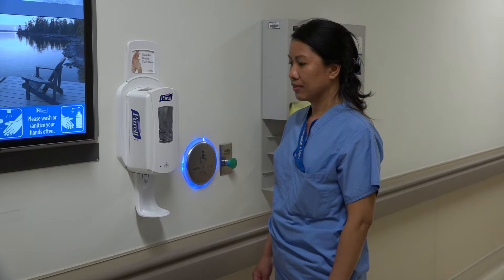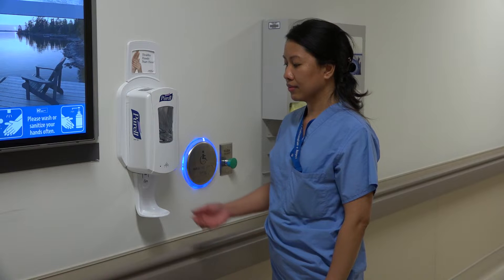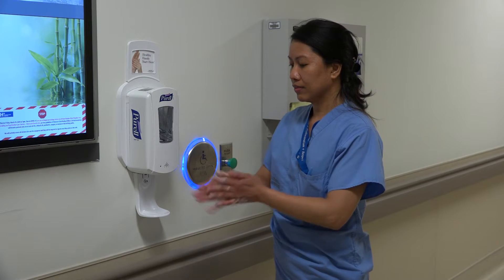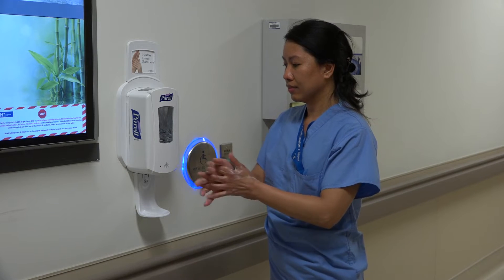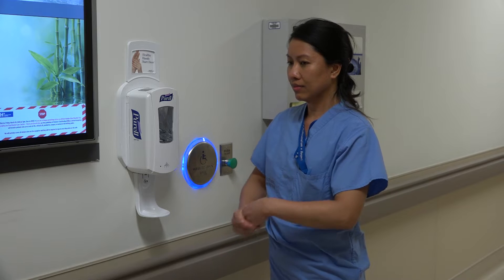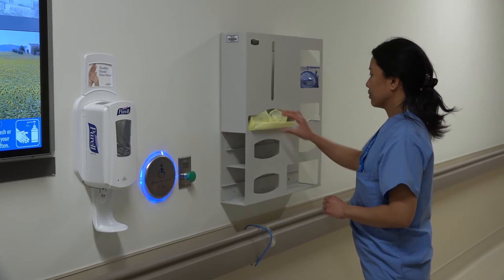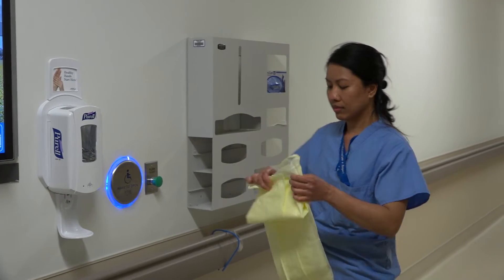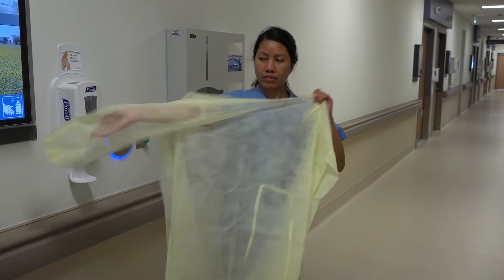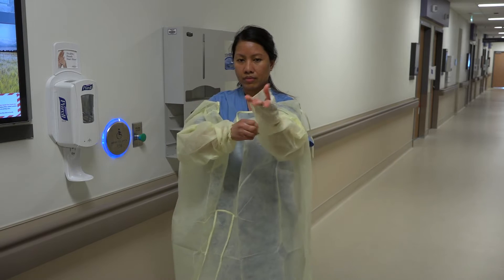Our nurse is going to show us the first step for donning for droplet precautions, which is to wash her hands. Step two involves placing the gown. This is the yellow droplet precaution gown that is to be worn, also known as an isolation gown.